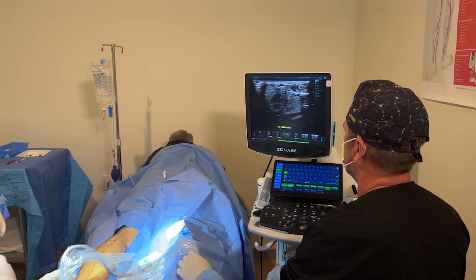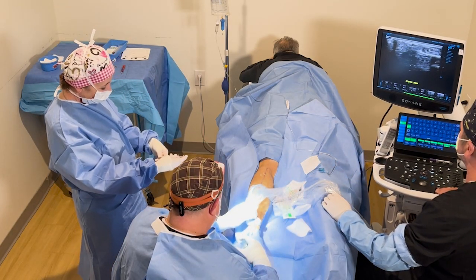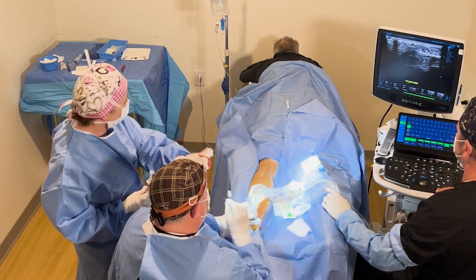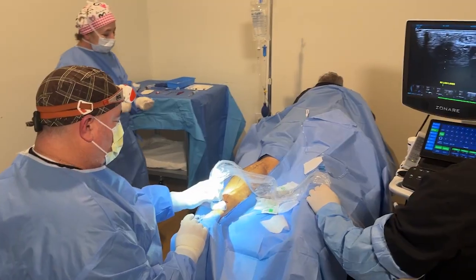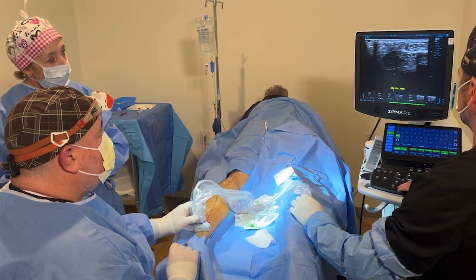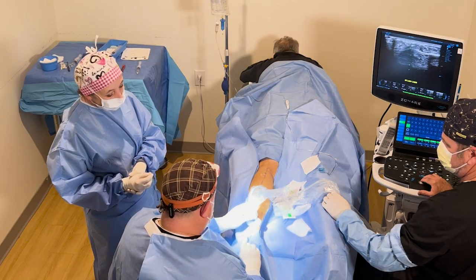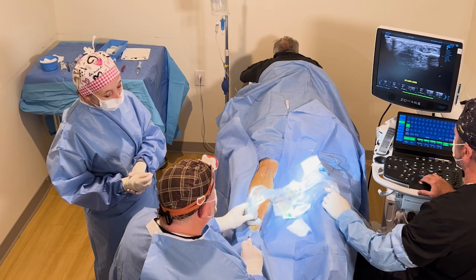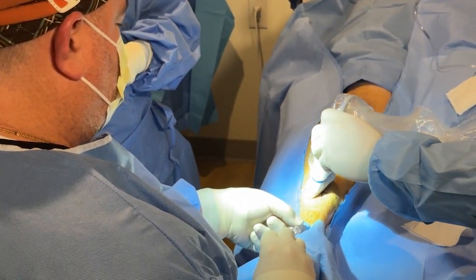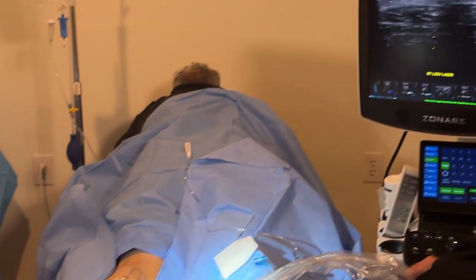We're going to do a little numbing medicine here so we can get access to the vein. We can put a wire in there, so we have a finder needle. If you look at the screen, you'll see the tip of the needle — that white dot there — going right into that vein. What we'll see is a splash of blood here, so we know we're actually inside the vein. And as we watch up on the screen, you can see the tip of the needle.